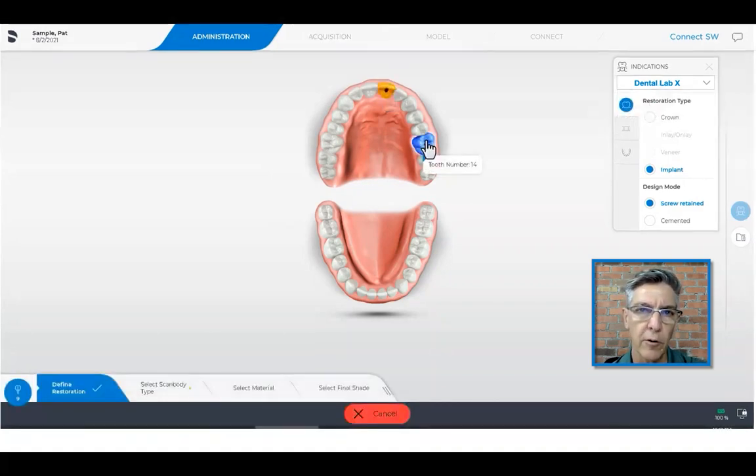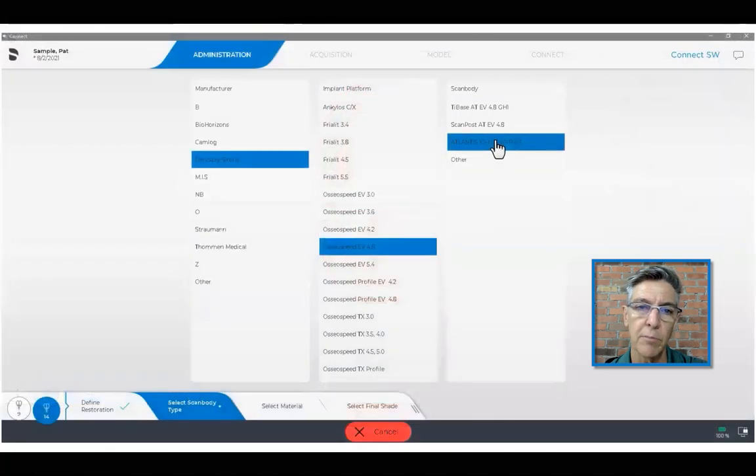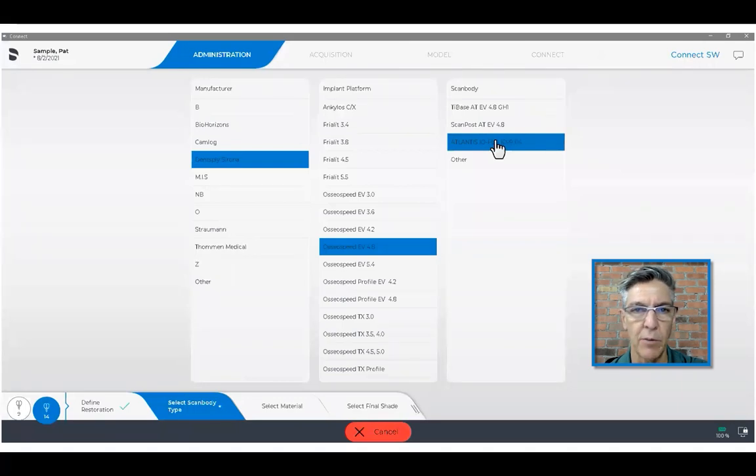Now, if you're already ordering one abutment, then you can just move on, but sometimes we have more than one implant. So I'm going to demonstrate quickly a feature where we're going to select our scan body. We're going to choose the brand of the implant, the type of the implant, and the size, and then click on this. I happen to use the Atlantis IOflow scan bodies.